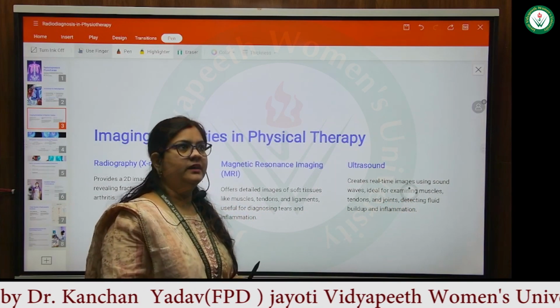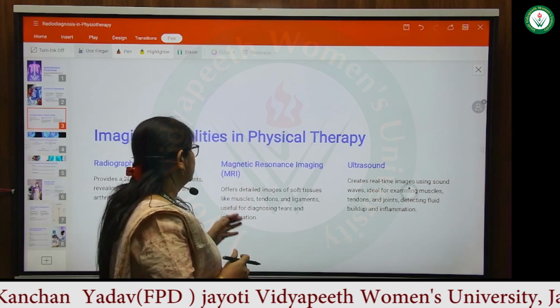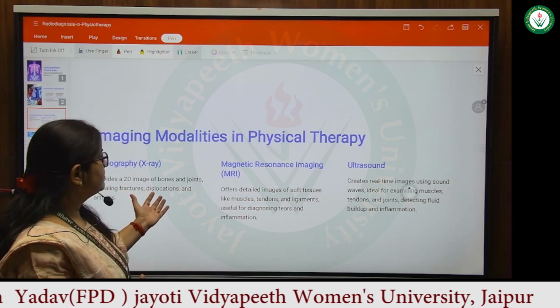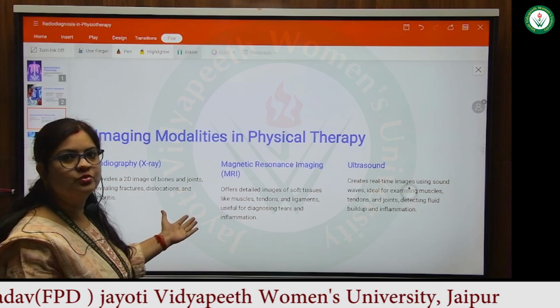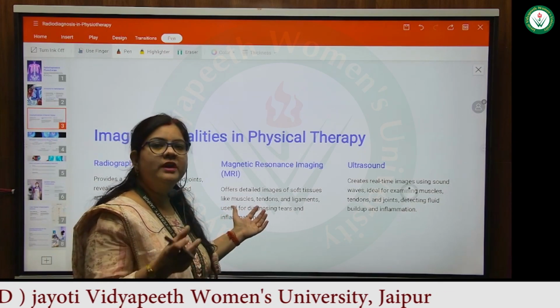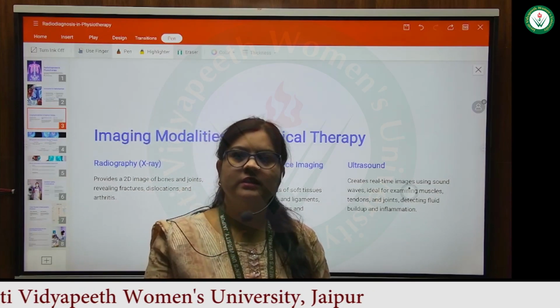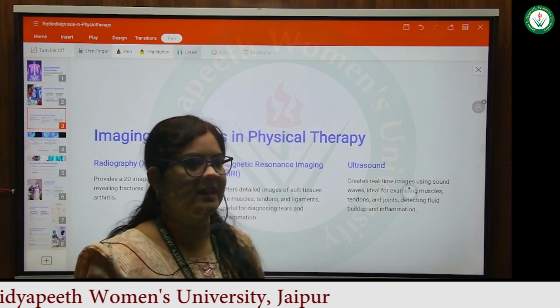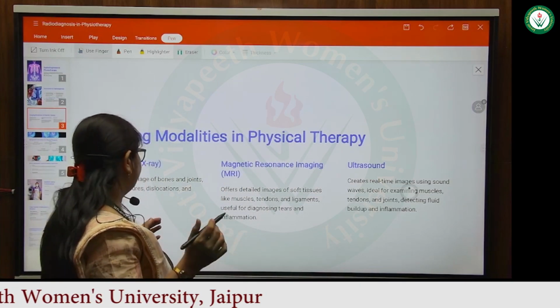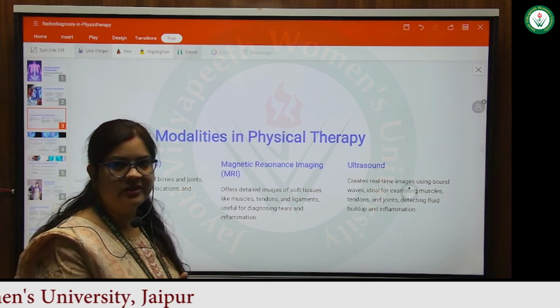So when we are talking about radiographic imaging techniques, let's look at the different radiographic modalities which we are using to check abnormalities, to understand the image, and to interpret that particular medical condition from the image. Afterward we can make the diagnosis and the findings, or we can make a particular protocol of treatment.